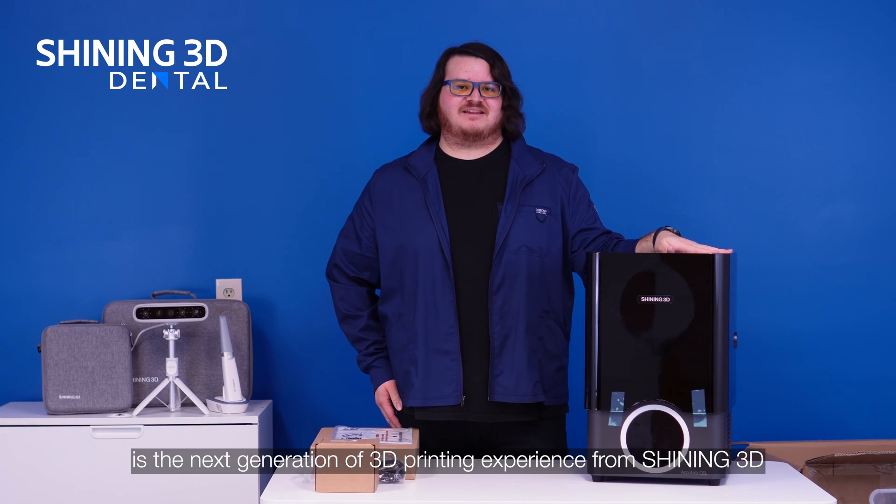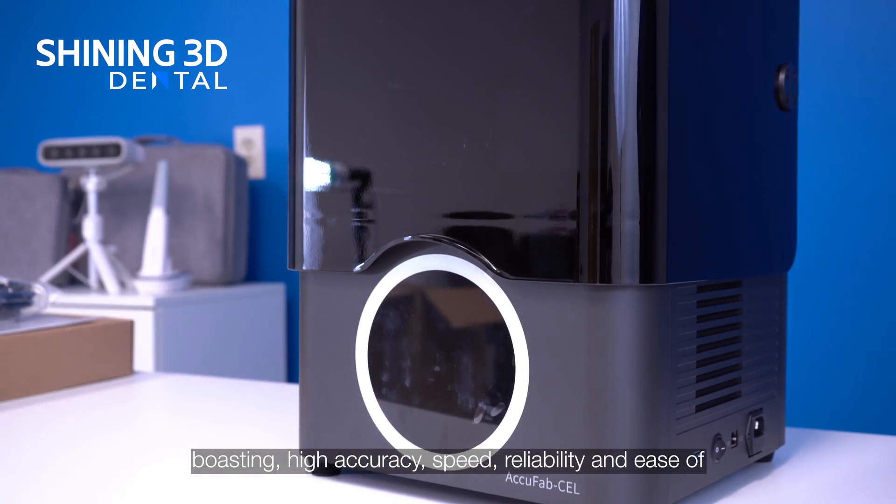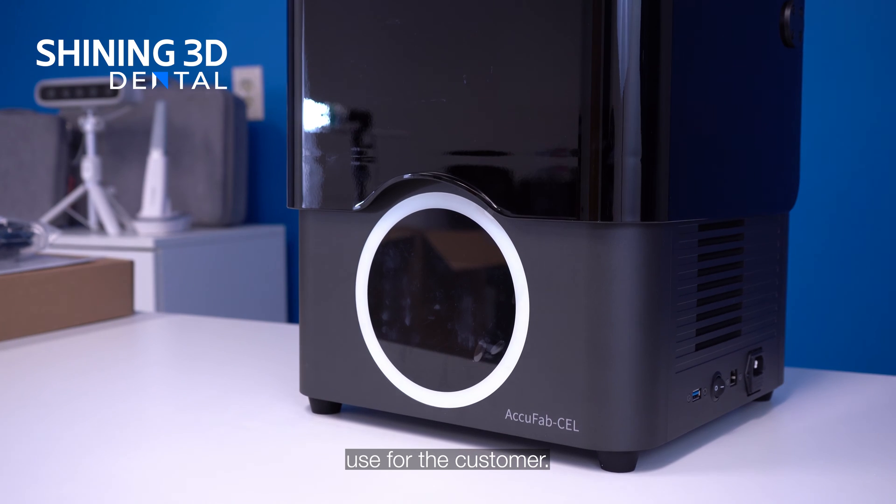The AccuFab-CEL is the next generation of 3D printing experience from Shining3D, boasting high accuracy, speed, reliability, and ease of use for the customer.